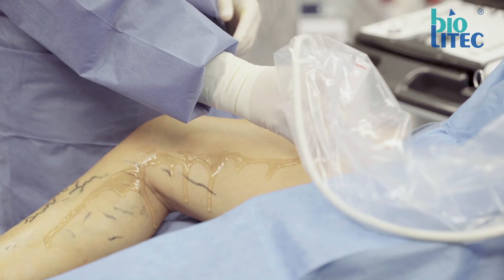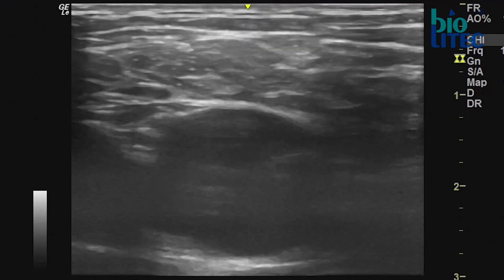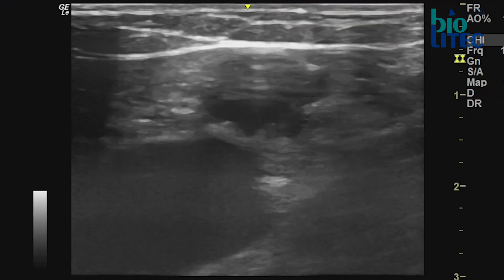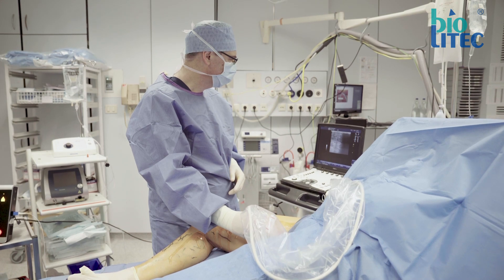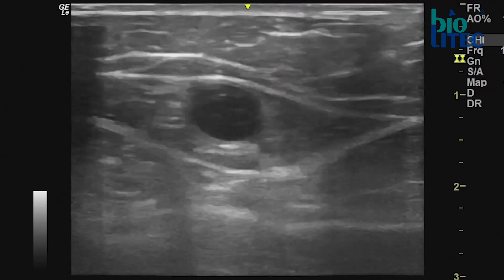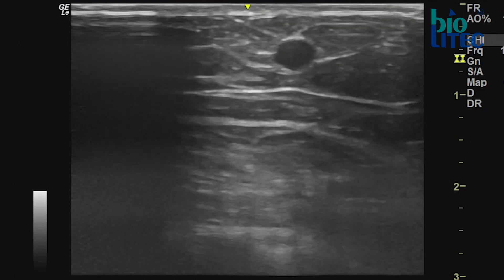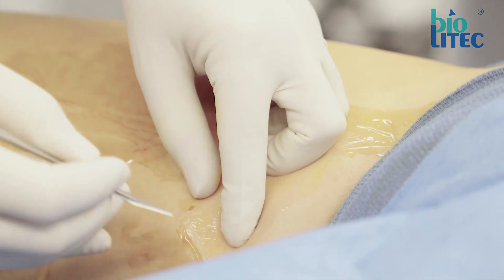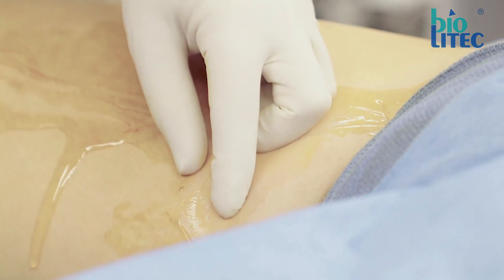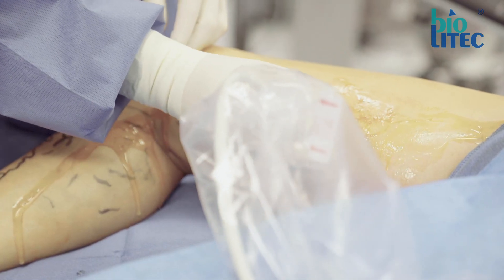The most tricky but also the most exciting and rewarding part of EVLT is getting access to the vein by ultrasound-guided puncture. Once you are familiar with that, I am convinced that whatever you can see you can puncture. So we not only treat an insufficient greater or smaller saphenous vein, but if necessary also medial and lateral accessory saphenous veins or Giacomini veins.